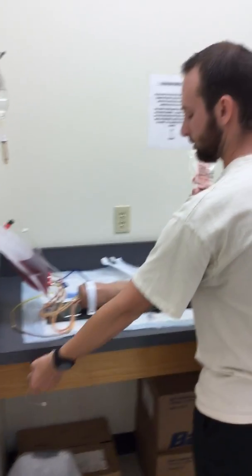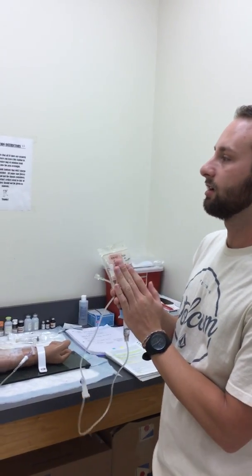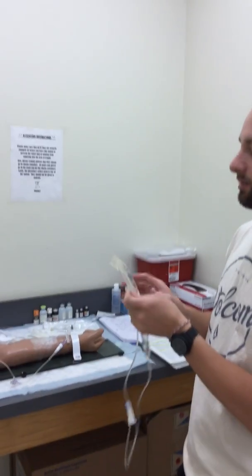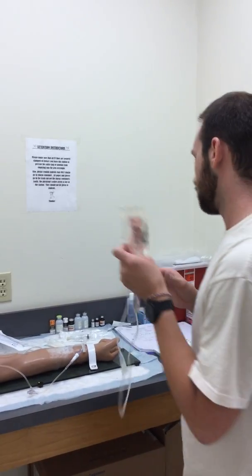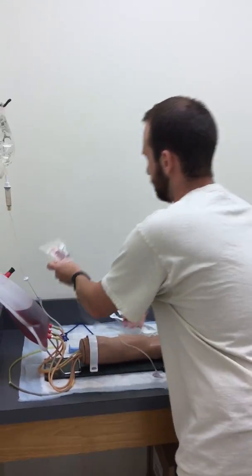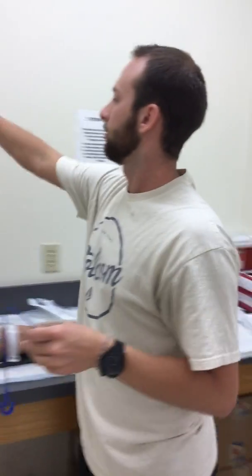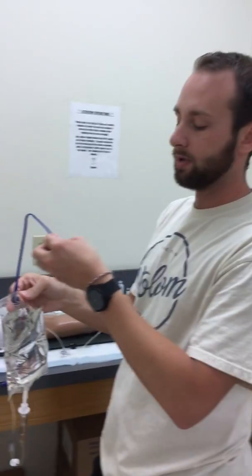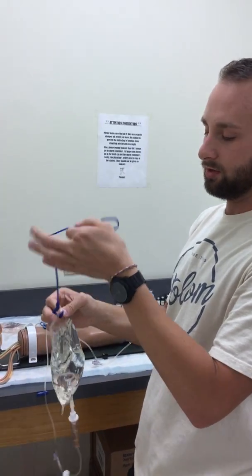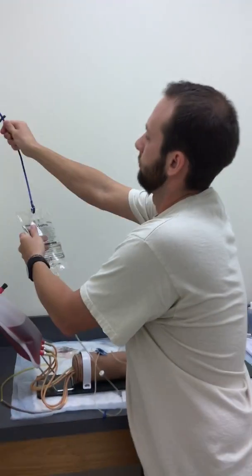Okay, now that that's done, we're going to again check the MAR, make sure this is a safe dose, is compatible with your fluids, and it's not interfering with anything. And it is compatible with D5W. So before we get this, we're going to want to, again, check for patency, make sure it's going good. We're going to want to lower this and check for return. And we're going to lower our primary bag because of gravity. We want the piggyback to go in.